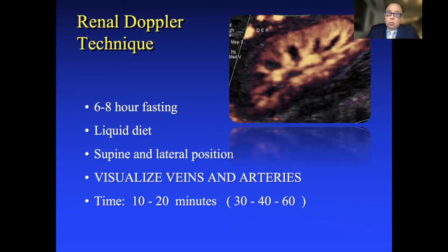In ours, we recommend liquid diet. The study is done in supine and lateral position. The objective is to visualize veins and arteries. The time for the study is 10 to 20 minutes if you are trained and you have a good equipment. If you are in your learning curve, probably you can take 30, 40, or even 60 minutes.